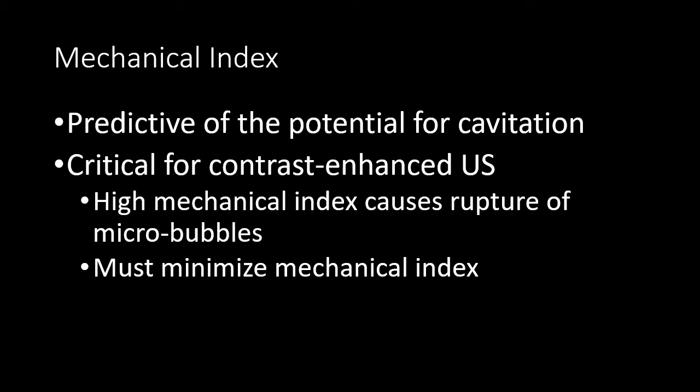Most of the time we are using a low enough mechanical index that we are not going to cause cavitation of the tissue. There are therapeutic uses of ultrasound where targeted ultrasound can be used to ablate lesions or classically break up renal stones.